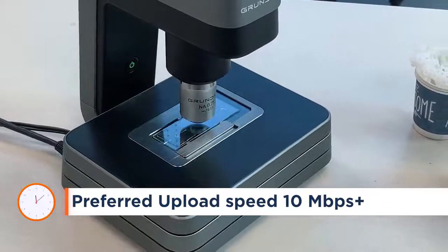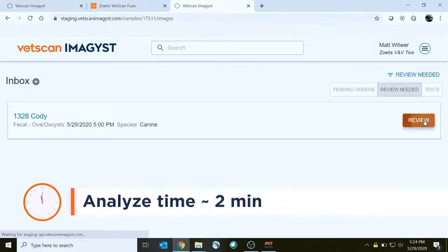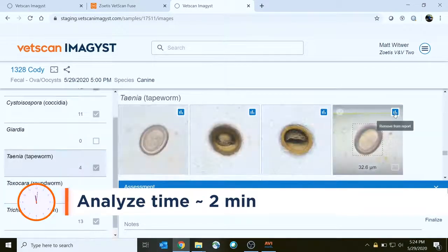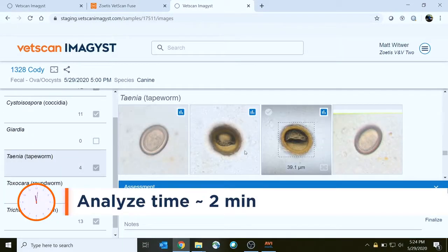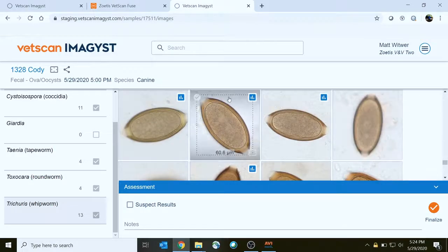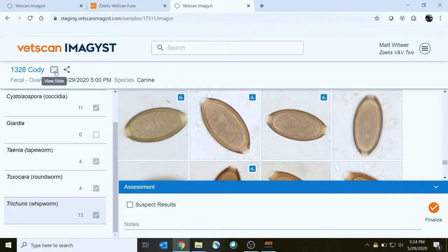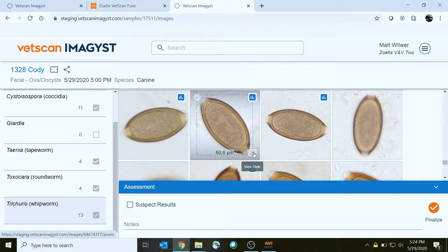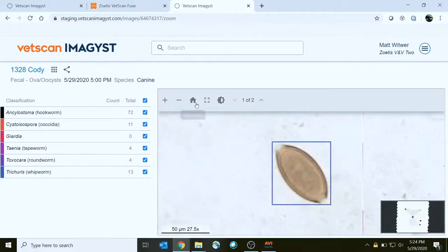Once the scan is complete, review the sample results. Review any of the captured images and select or deselect for inclusion on the report. In addition, you may view the entire slide by clicking on this button, or clicking on the button for a positively identified parasite — Imagist will open the slide view and zoom in on that parasite exactly where it's located on the slide.